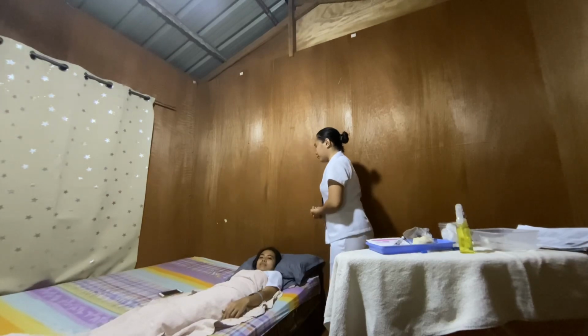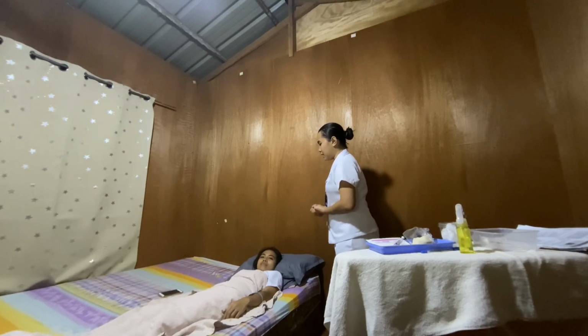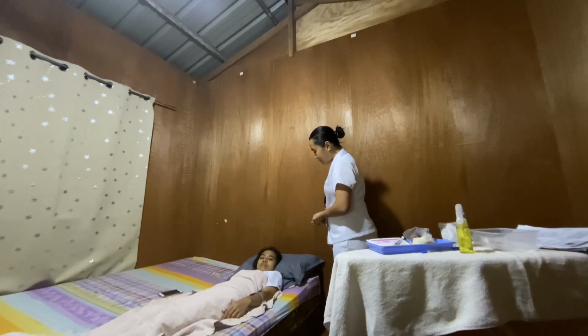Today I will be performing an intradermal injection, also called a skin test. I will be injecting a particular medication on your forearm, and this is to check if you are allergic to the medication or not. Is that alright?